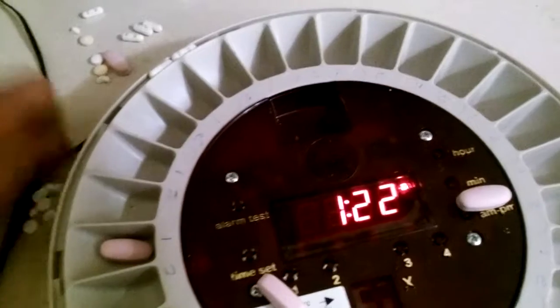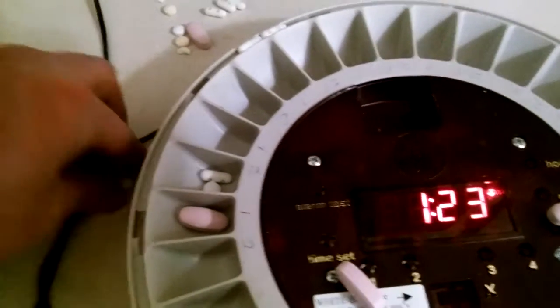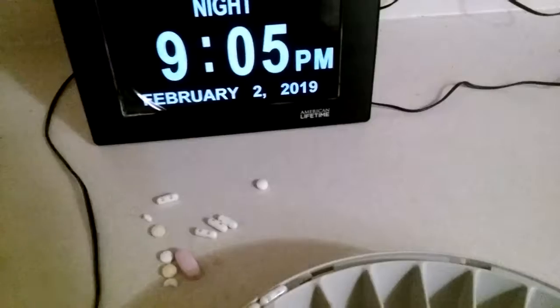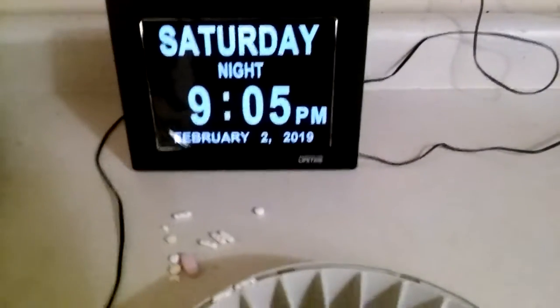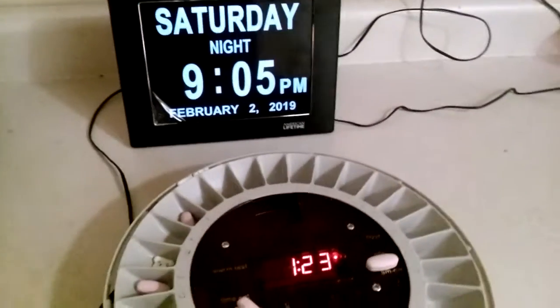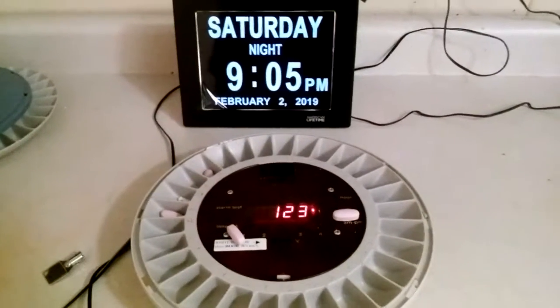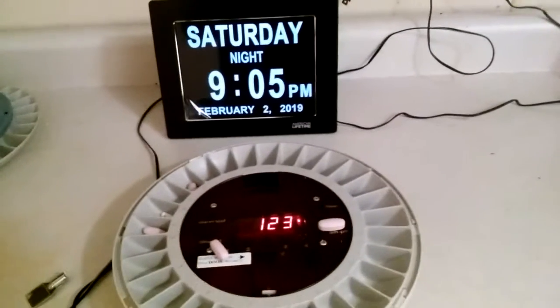Pretty much a quick and dirty review - we've had these for a while. We just had an unreliable person who loved to go into their meds. These are very good overall. For power outage they last at least a day off the battery. This clock should last a couple of days. With a $40 battery backup from a local computer store or hardware store, you should be okay if you need them to last longer.